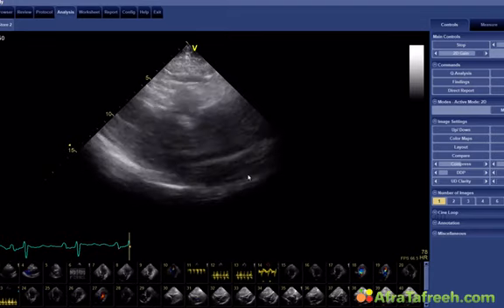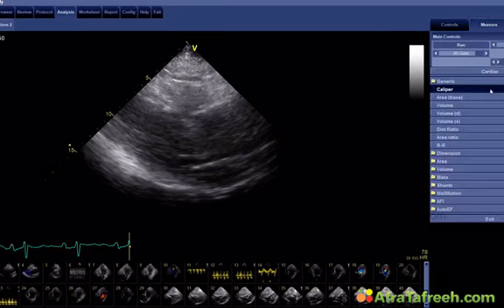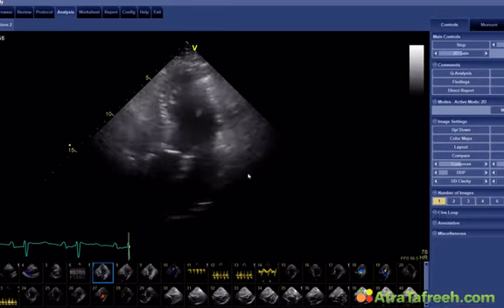Now, the pathology most of you will probably recognize immediately is the aorta here. What you can see here is that the aorta is significantly dilated. This is what we would call an aneurysm. Normally, the width of the aorta is somewhere in the range of maybe 36 to 40. That's the upper limit, but in this case, it's far beyond that. But how does that have anything to do with dyspnea?